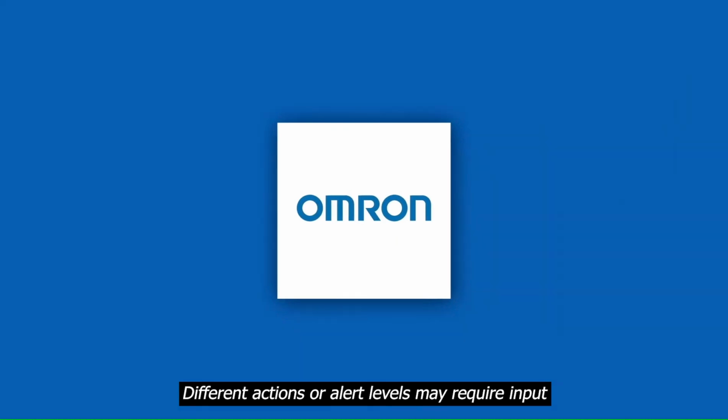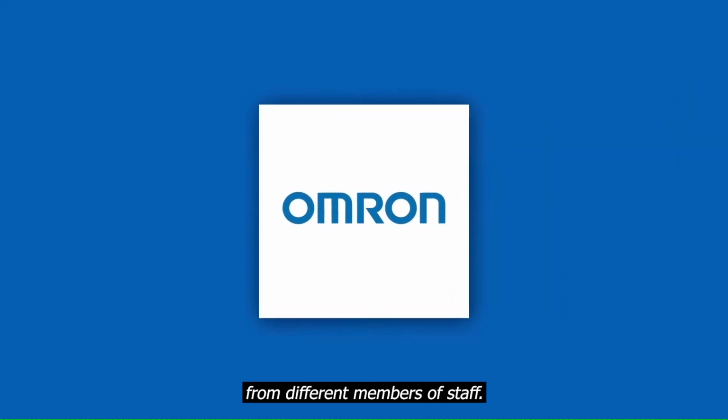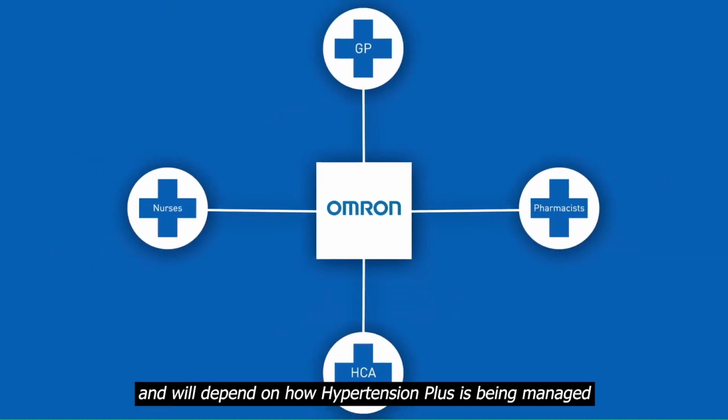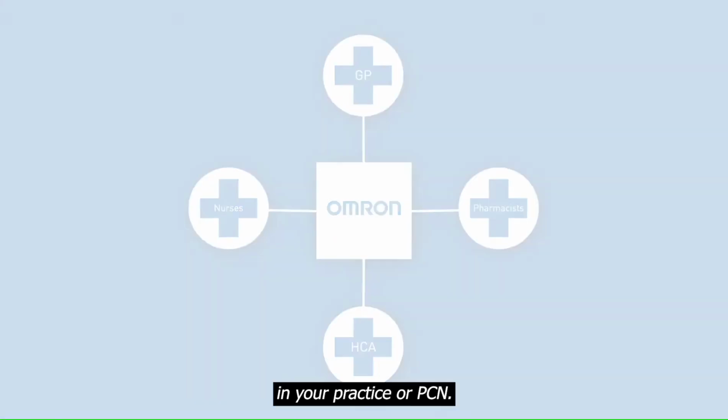Different actions or alert levels may require input from different members of staff. These roles and responsibilities may vary and will depend on how Hypertension Plus is being managed in your practice or PCN.